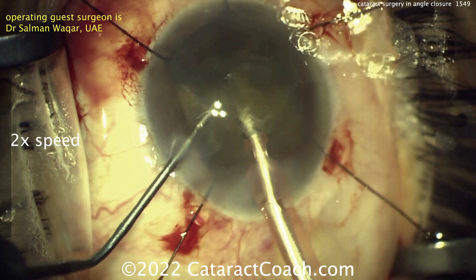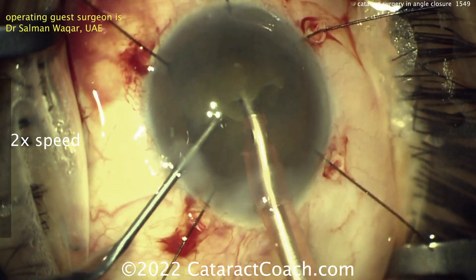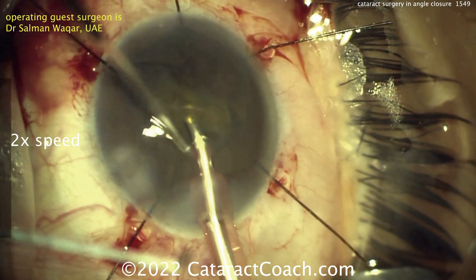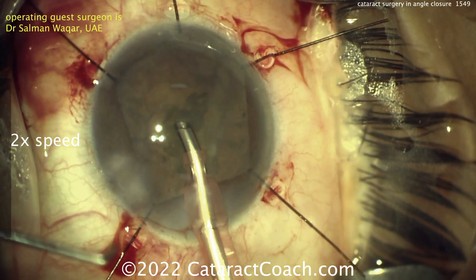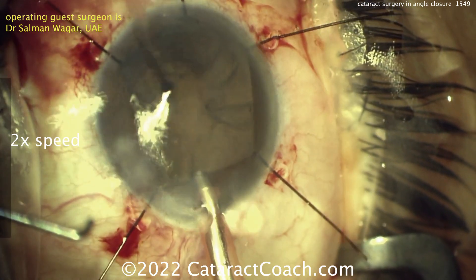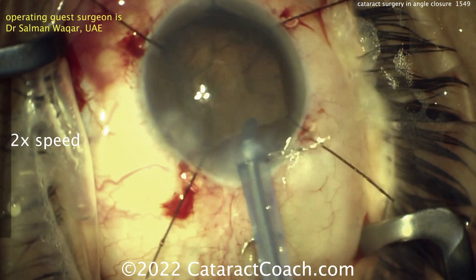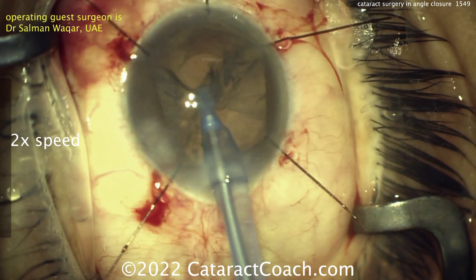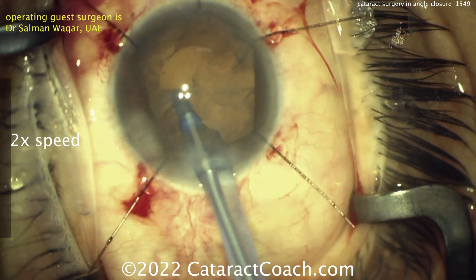This is a tough case to do. I do like the idea of the iris hook keeping the iris out of your way. You don't want to do a pupil expansion ring in most of these cases — in my opinion, because that takes up volume too. When you're putting more stuff and crowding the anterior chamber even more, it's a little harder to place. I think there's more flexibility with the iris hook, so I do like the idea of iris hooks.